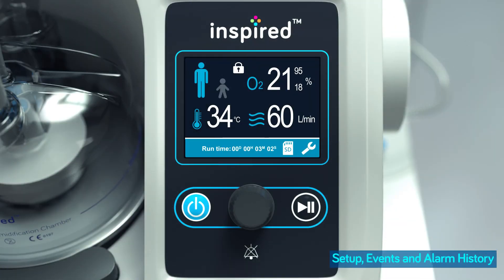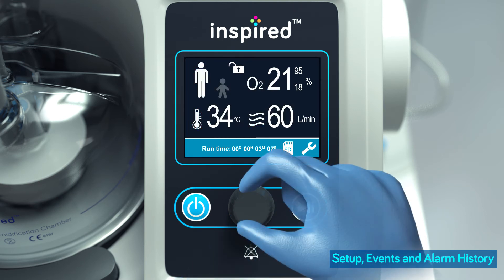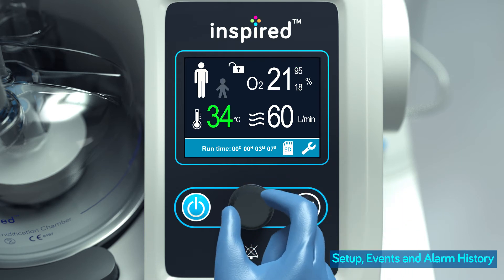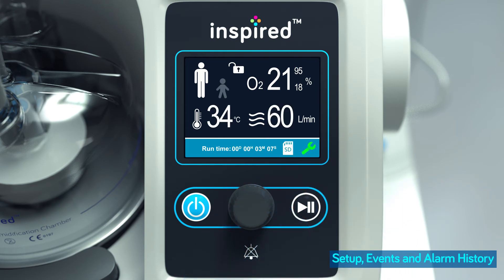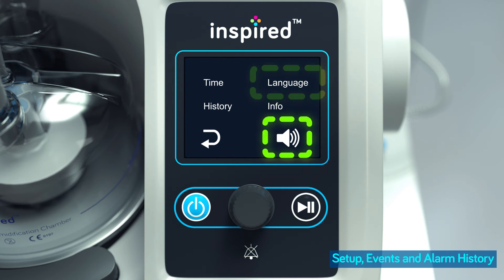O2 flow must stop running for changes to be made to the machine settings. When the unit stops, rotate the control knob to highlight the settings icon, then press the control knob to bring up the settings menu. Users may change time, language, and volume settings, as well as access alarm history, device setting records, and information from the settings icon on the main screen.